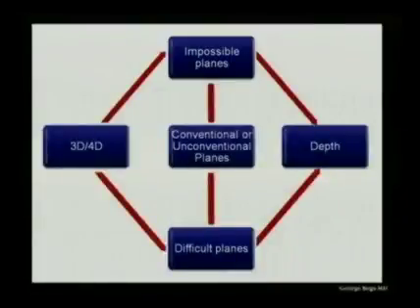So here is an overview, a diagram that basically goes over these main concepts. 3D ultrasound, or a volume ultrasound, and by the way, in this presentation I'll be using both of these terms interchangeably, either 3D, 4D, or volume ultrasound, and we're going to go in detail a bit later on this, can provide us impossible planes or difficult planes with depth.